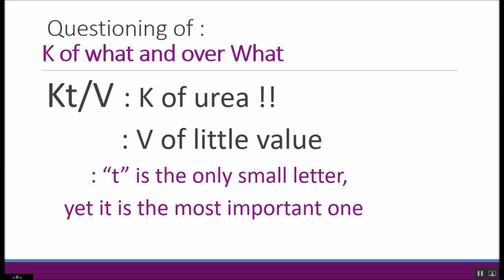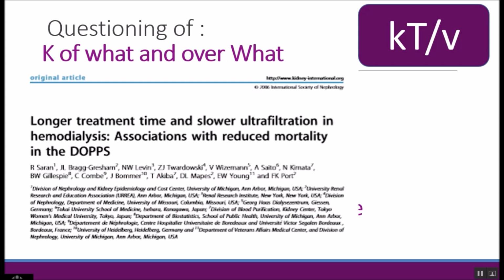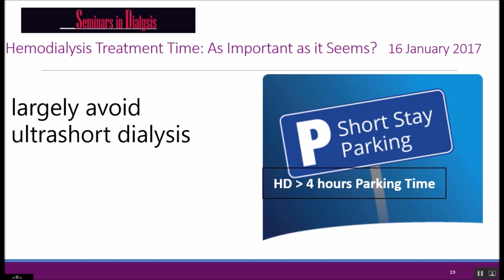We have to stress the time of the dialysis session, the length of the dialysis session. Increasing the time is the most important one. Keeping your patients on a long dialysis session is the most important factor in adequacy of hemodialysis. Don't go for shorter dialysis sessions with very fast blood flow and a bigger dialyzer, because you will find huge rebound after that. At least 4 hours is required for each dialysis session.